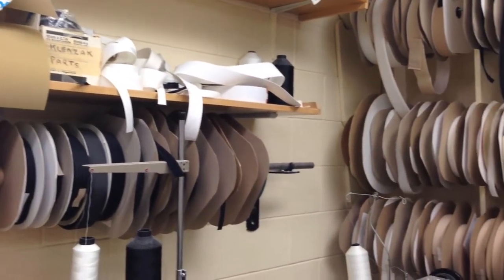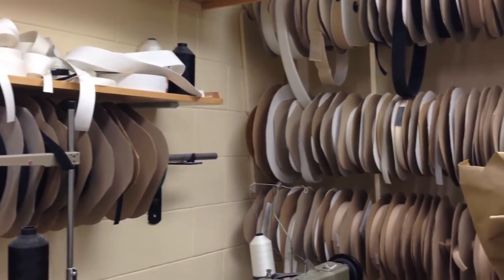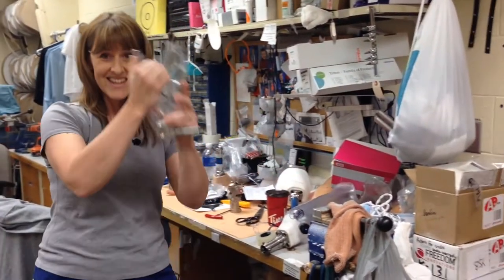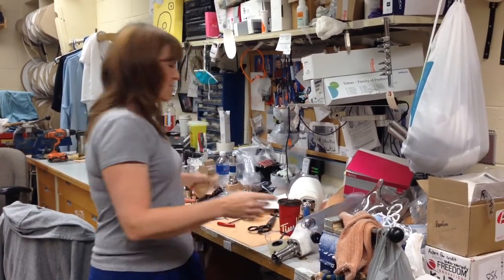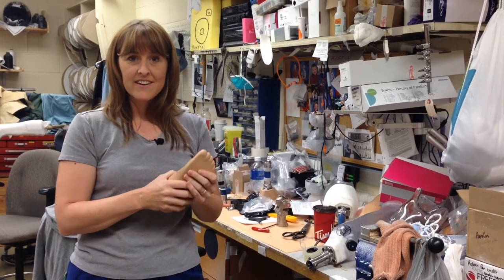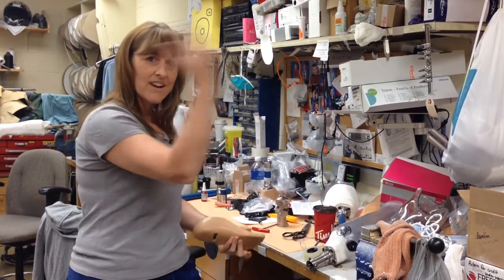They do their sewing, they build custom leather straps, and they assemble all of the pieces of the prosthesis. They take it from this and assemble all of the feet, the knees, the liners — everything. They put it all together and build it so that I am ready to put it on my patient.